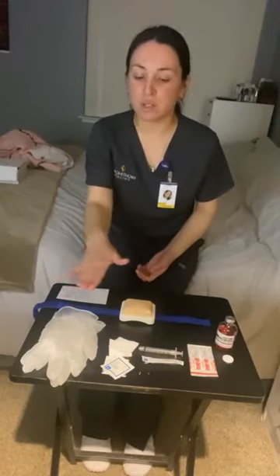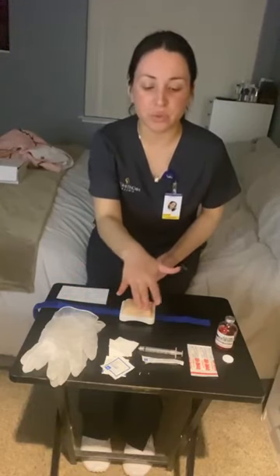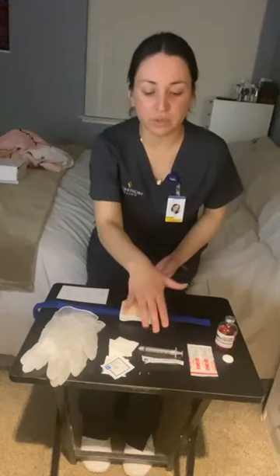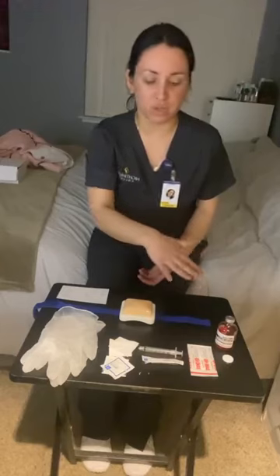I have gloves, alcohol swabs, alcohol pads, gauze, a 22 or 25 gauge, 1 to 1.5 inch needle. I have a 3 milliliter syringe, a band-aid if necessary, and the medication vial.